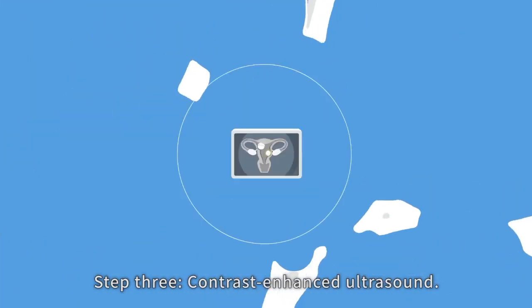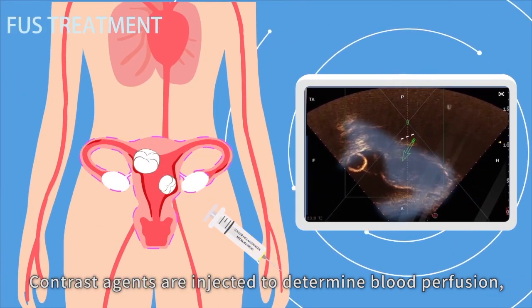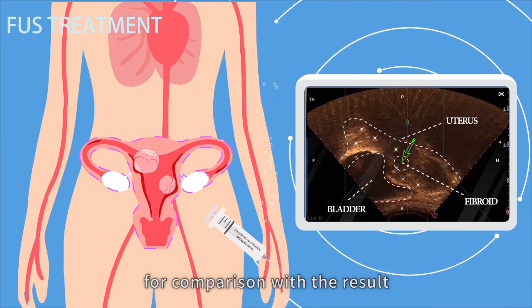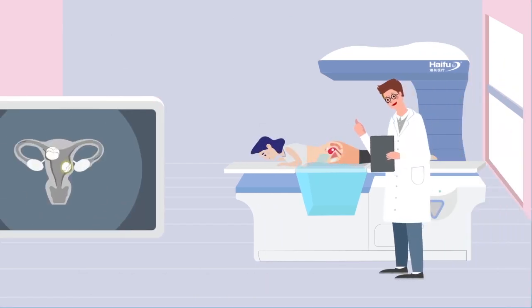Step three: contrast enhanced ultrasound. Contrast agents are injected to determine blood perfusion, to estimate the level of difficulty in treatment, and to distinguish fibroids from normal tissue for comparison with the result of post-treatment contrast enhanced ultrasound.